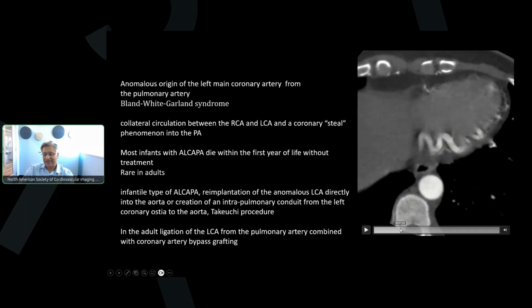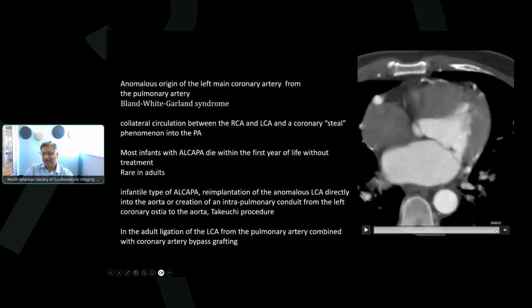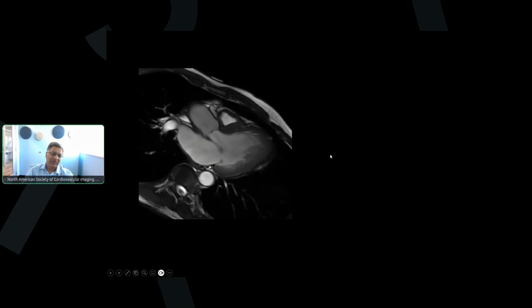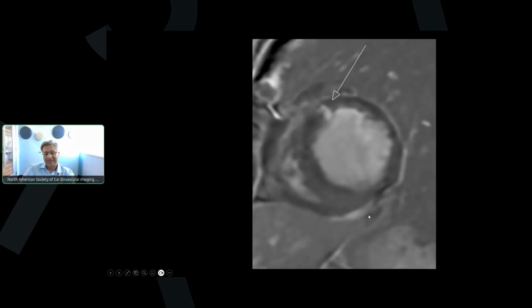This patient also has, if we go back to look at the mitral valve, there is some thickening over here. We can't really talk about anything more than that. So this patient underwent an MR before surgery to evaluate the mitral valve better. And what you can see over here is this mitral regurgitation, mitral valve thickening. There is also aortic regurgitation. And then when we did the delayed enhanced images, we can see these focal areas of delayed enhancement. So this is nearly transmural in the anterior septum, and this is subendocardial in the anterior wall. And these were probably the reasons for the chest pain presenting in these patients.